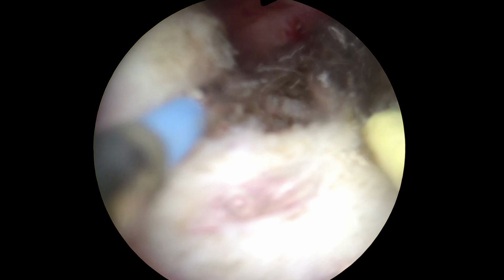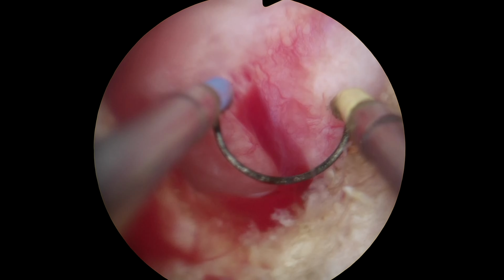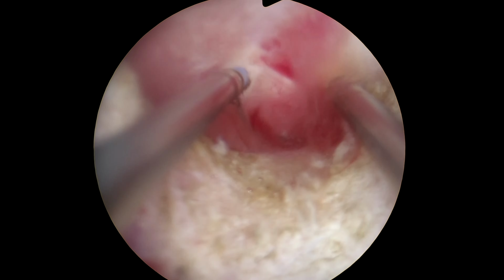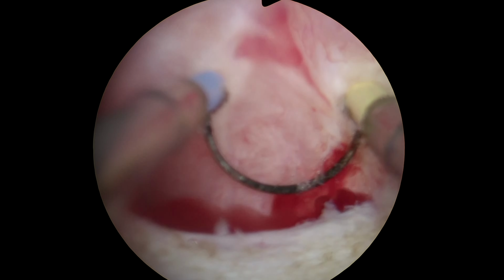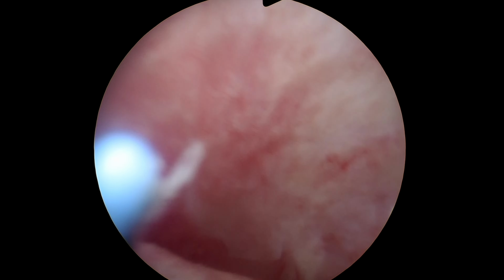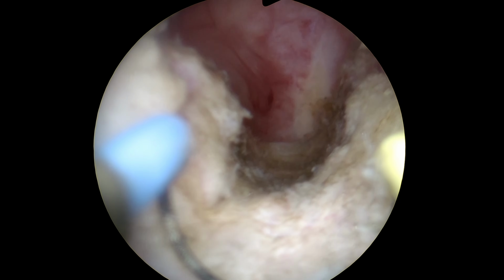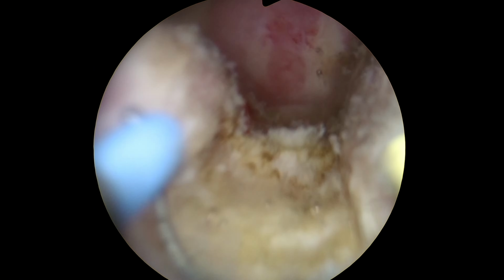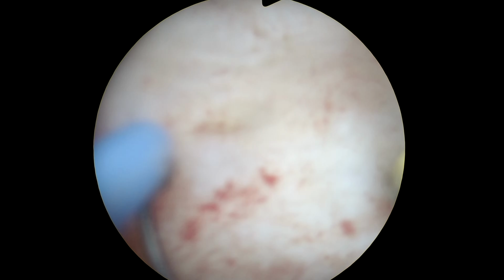To accomplish this task, I resect the fibroid into two parts in the center, thus providing a uterine cavity overview and the fibroid pedicle becoming visible. I continue tissue resection to the end to open the posterior wall of the uterus, which will make our work much safer.